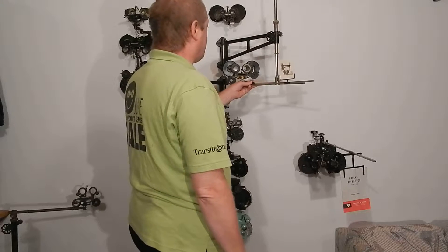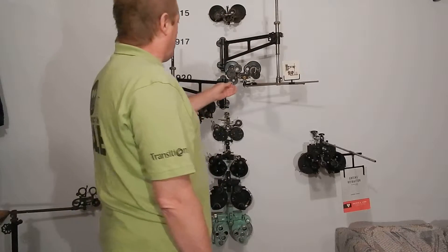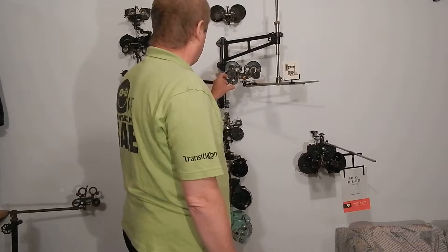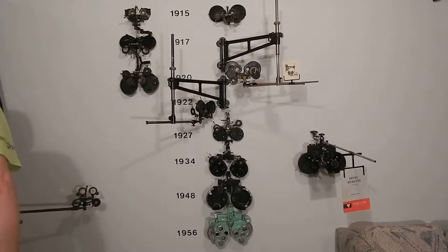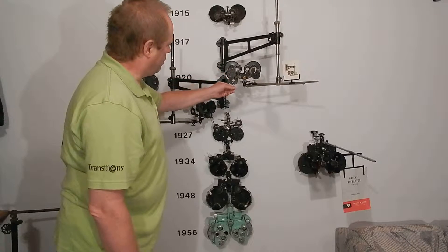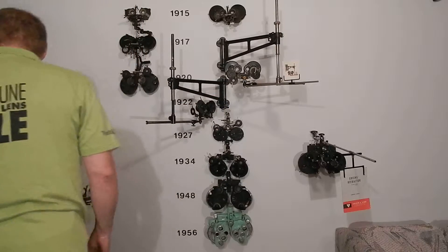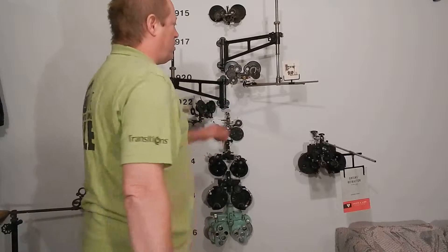The 1920 model has a Risley prism on each side. This one doesn't have a Maddox rod — it actually has cross cylinders. The cross cylinder on this doesn't flip like a regular cross cylinder; you have to rotate it. I'm not sure you could give an exam saying 'which is better, one or two?' with that. I think that's probably for the 14B — I don't think it's a real Jackson cross cylinder. It's got white dots and red dots, and a near point card.